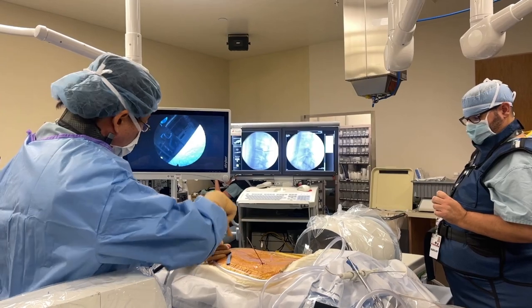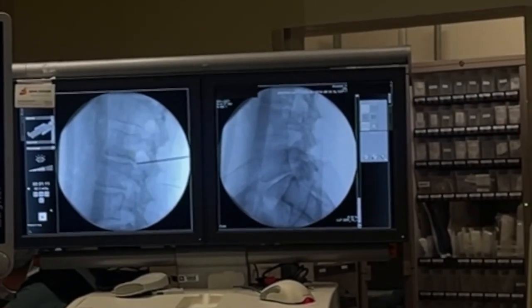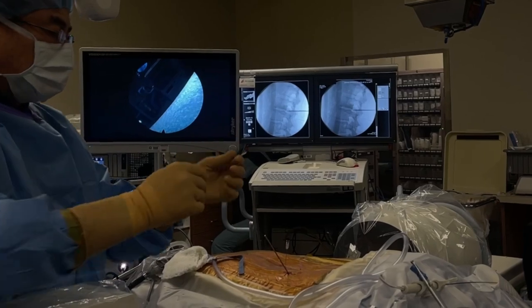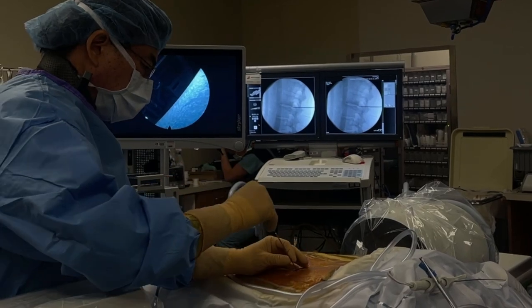It went through the foramen and it's resting on the back of the spine. Look how far back it sits. I can feel that right there. That's the disc bulge and disc osteophyte. It's aiming toward the disc. You can tell it's sticking out. Now I'm gonna stick this tiny little needle into the disc and inject the blue dye into the middle of the disc and watch it leak out the back.